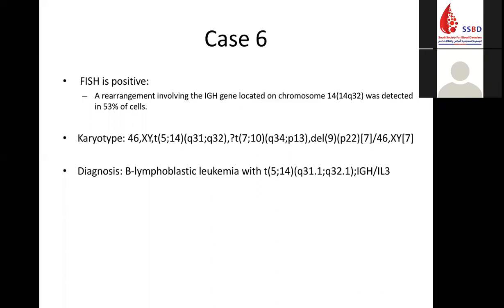But of course, you would put in your differential at the beginning, from the morphology, since there is an eosinophilia, that it may be inversion 16 and translocation 16;16, myeloid, but the morphology was very lymphoid for the blast. Is eosinophilia usually associated with lymphoblastic leukemia? No, of course not.